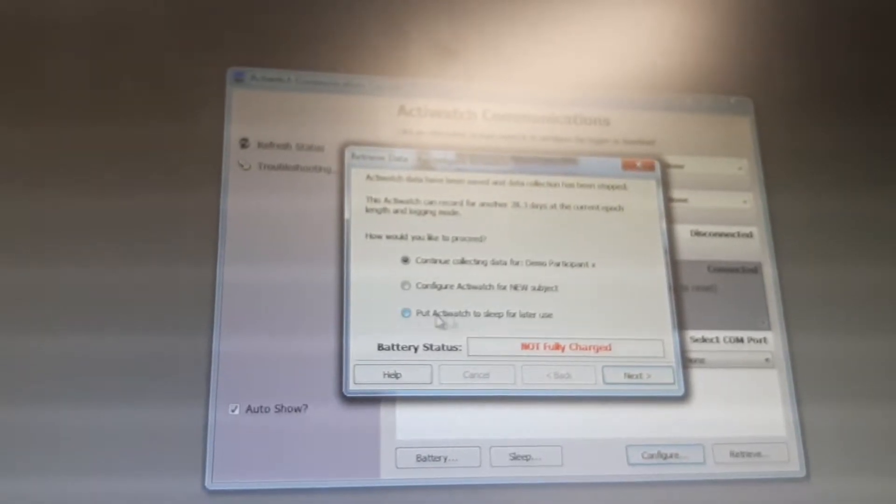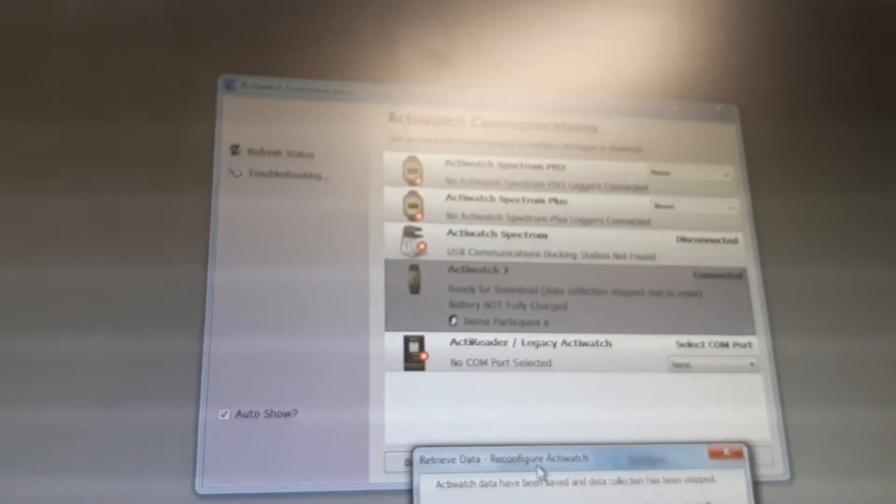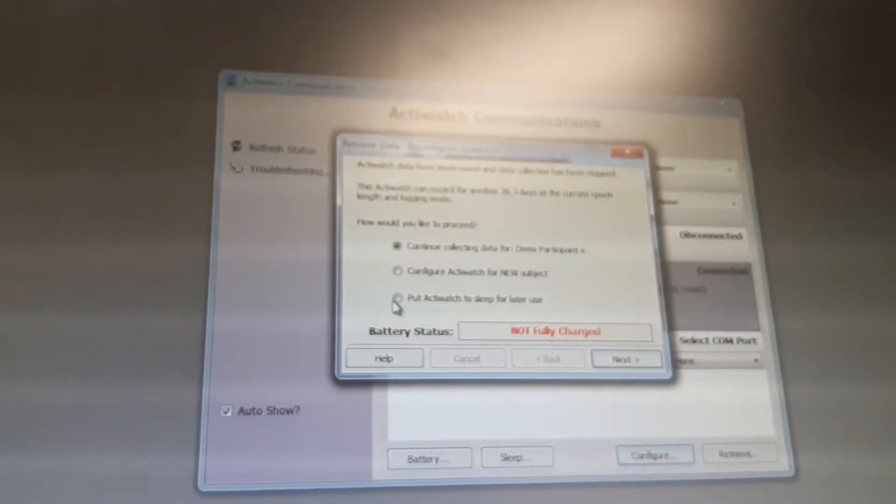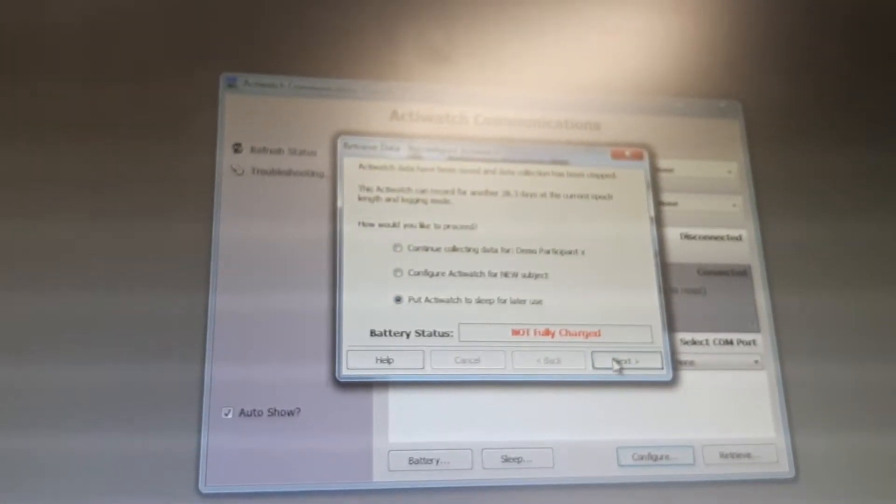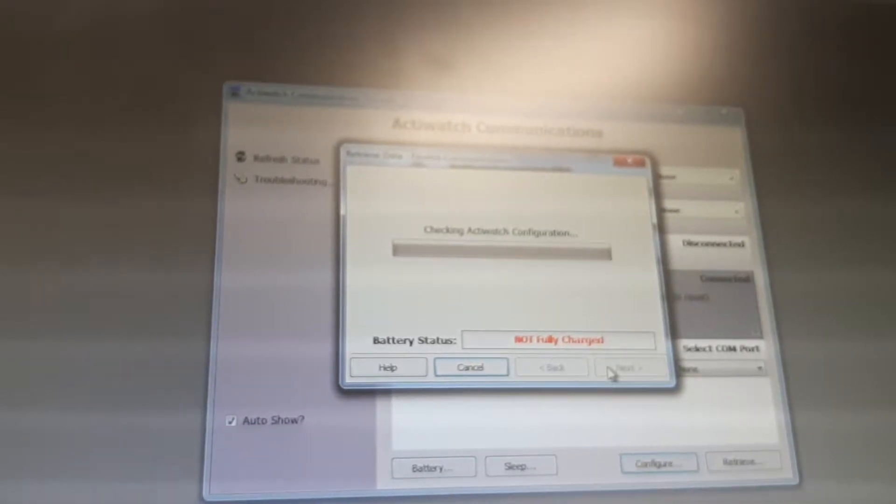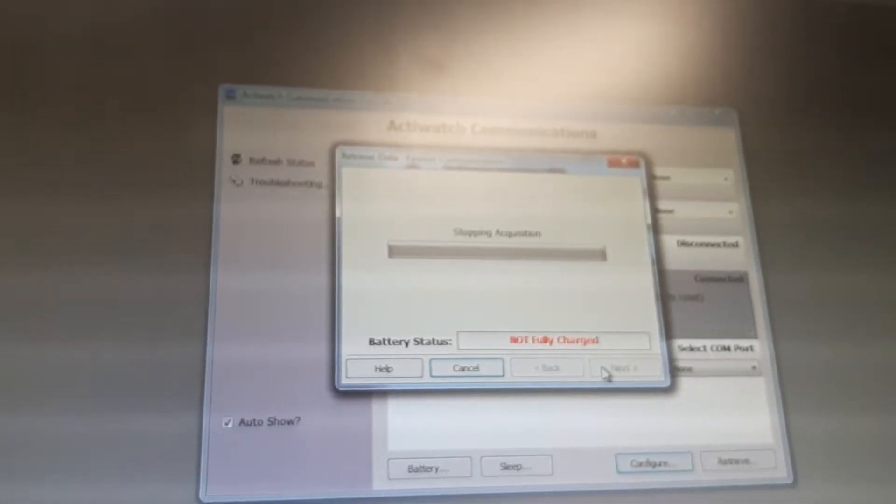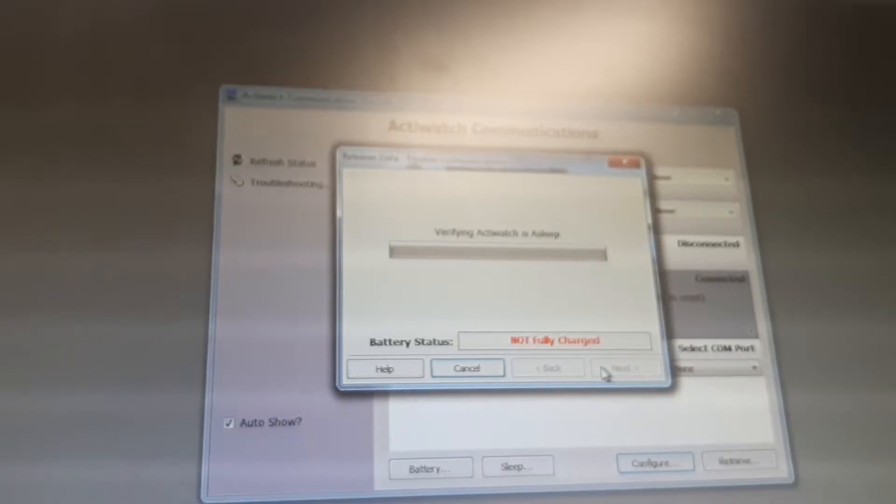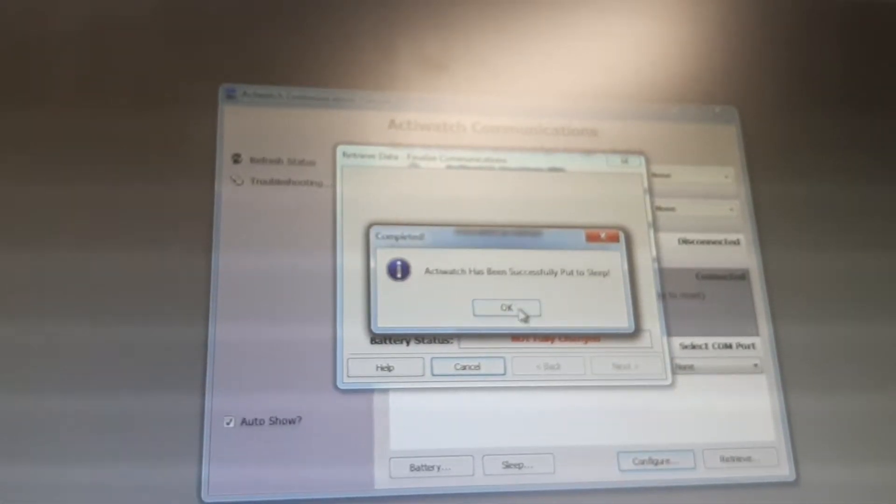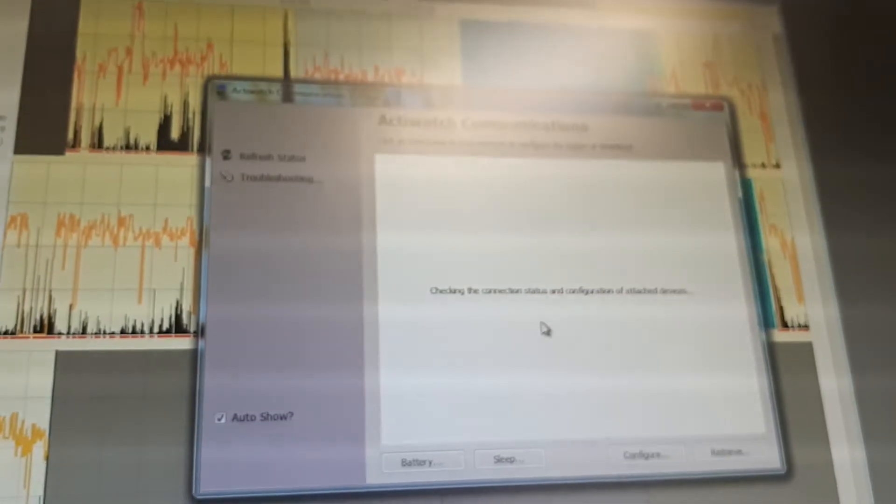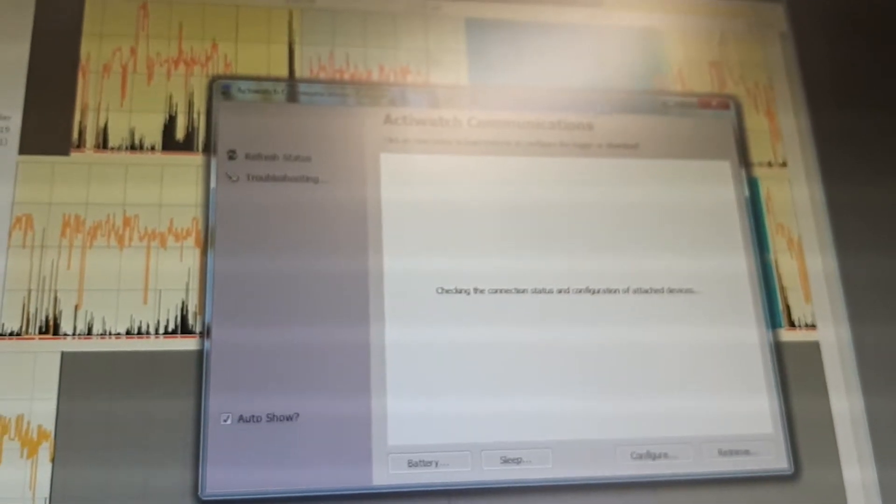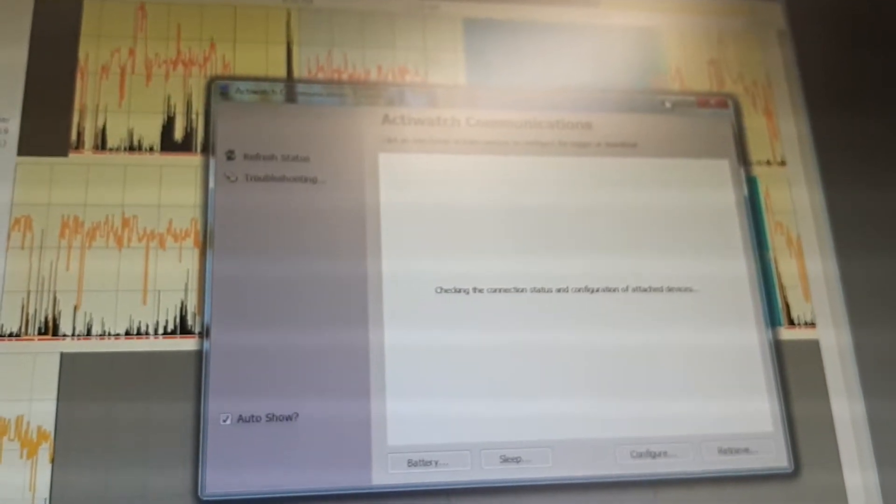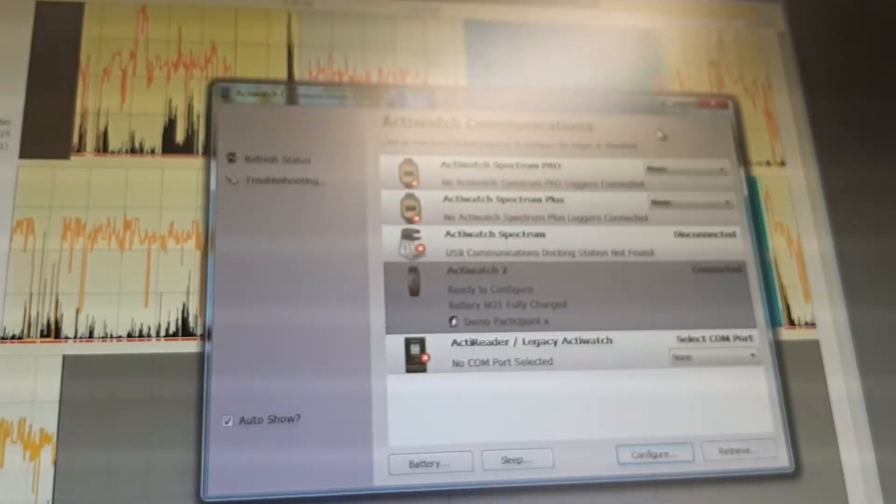So now I need to put Actiwatch to sleep for later use. Now I can see the data that has been collected throughout the last two days and nights.